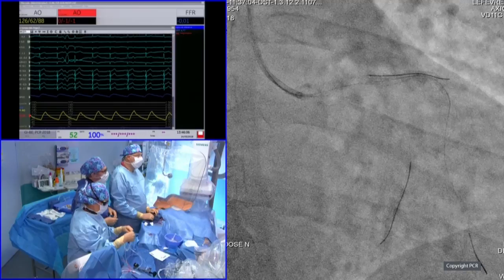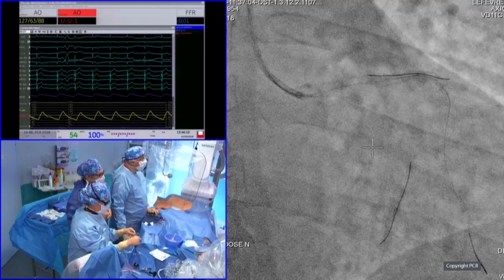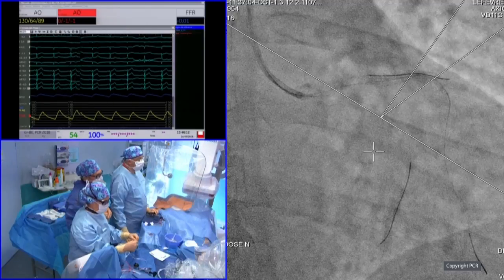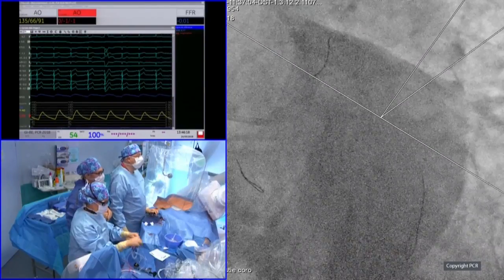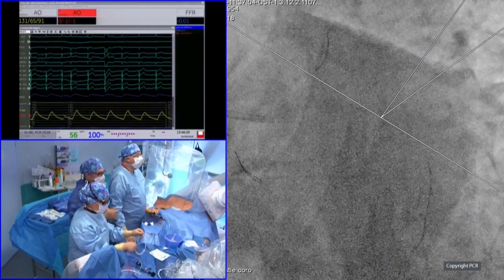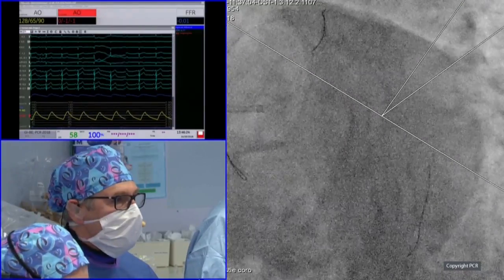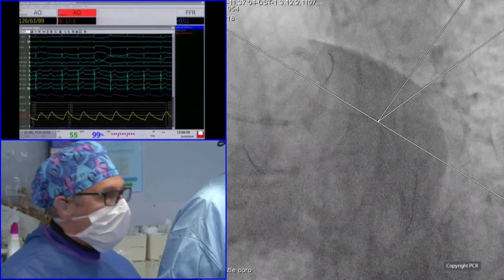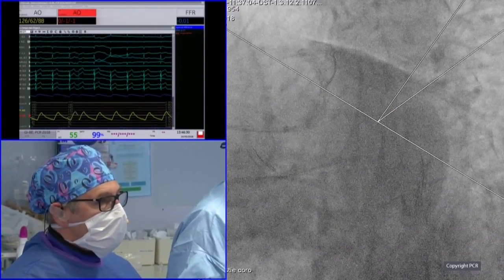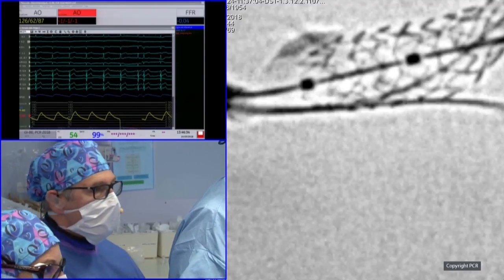Speaking of the ostium, maybe you can do an angio now. What do you think of the ostium of the left main, Thierry? We see a calcification at the top, or is it dye? Yeah, it's a big calcification. Oh, it's a calcification, so that's why you see the stent enhancement on this image. Okay. So Bernard will do another view in the spider. Yeah, we see it.